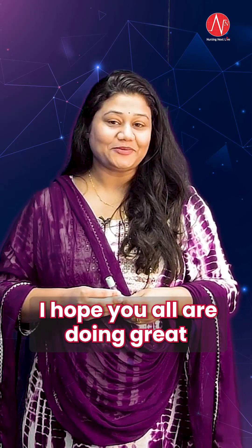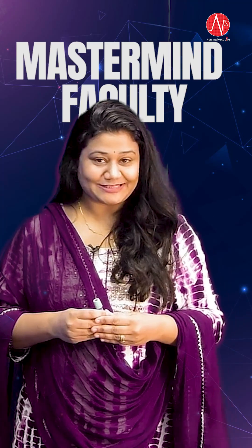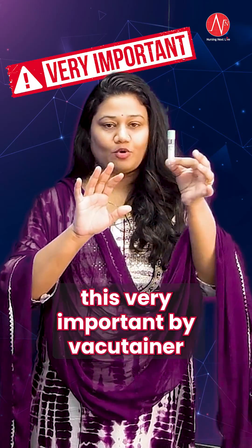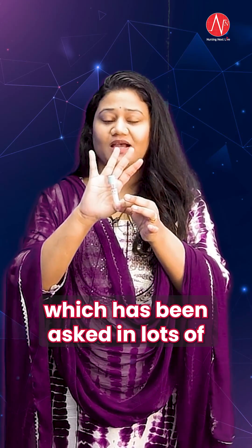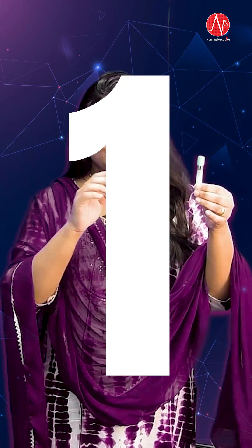Hello everyone, I hope you all are doing great and welcome to your Digital Coaching Paatshala Nursing Next Life. I am Sabina, your Mastermind Faculty and Norset Batch Mentor. Today we will be quickly revising about this very important vacu-tainer which has been asked in lots of government nursing officer entrance examinations.